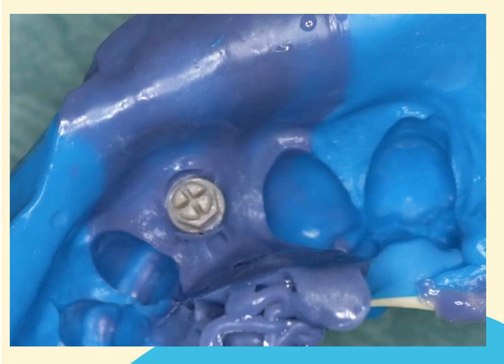When the impression is removed from the mouth, you should clearly see the clicking top secured in the material. If the clicking top has ripped out of the impression, do not try to reposition it. It will be necessary to clean the clicking top, remove impression material from the venting system, and repeat the procedure.